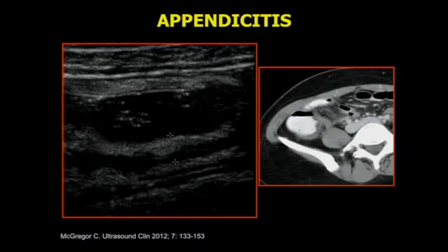Now, I'd like to show you this case of the cecum in a patient with appendicitis. And I think if you really carefully look at the bowel wall layers and critically analyze them, you can appreciate that the anterior wall of this cecum is much different than the posterior wall. There's far more thickening posteriorly than there is anteriorly. In addition, when you carefully analyze each layer independently, I think you will agree that the inflammation here is centered on the outer layers rather than the inner layers. And if we compare this muscularis externa to the very thin one anteriorly, there is clearly a difference.